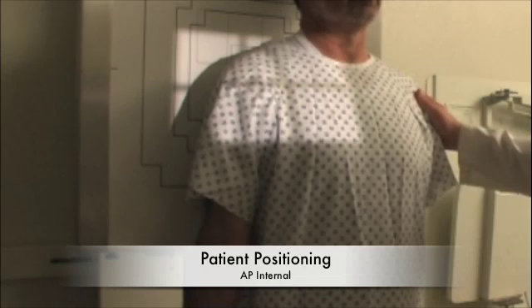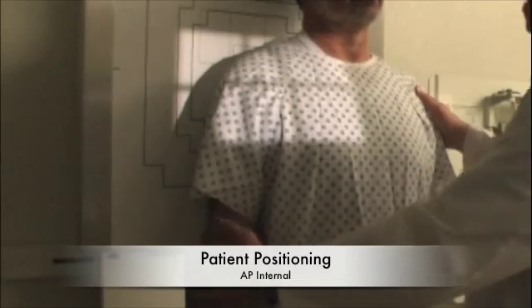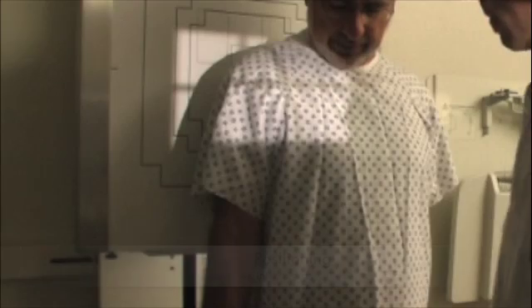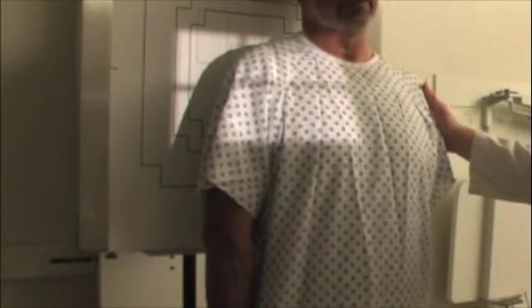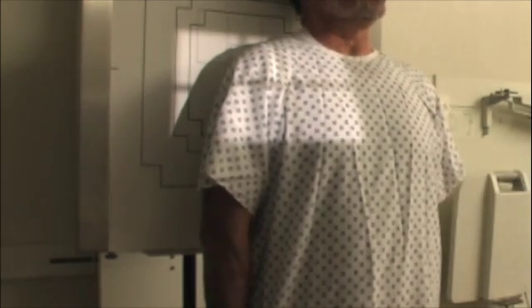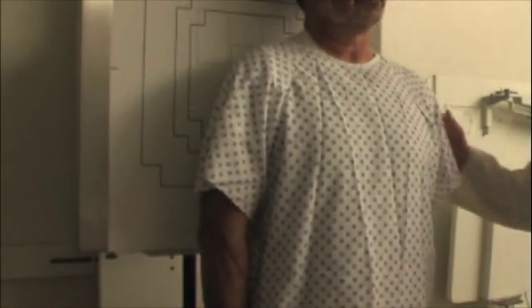All right, Mr. Smith, we're going to do one more picture in the same position. What I'm going to do different this time — I'm going to ask you to roll your arm in, kind of rotate it in towards your body. Like this? Yeah, that's good. I'm going to help you move it just a little bit more. Just like that, looks good. Same thing again — I'm going to ask you to take a breath in and hold your breath. Go ahead and do that now. Good. You can breathe, and you can relax. Great.